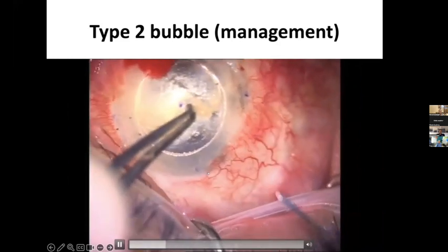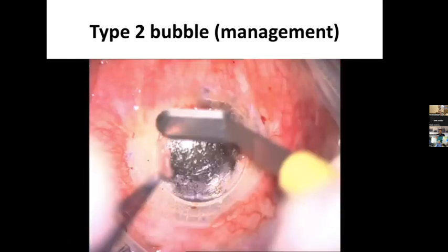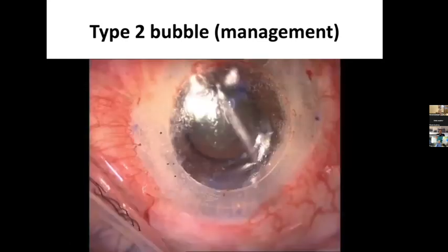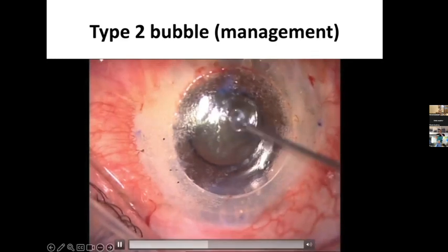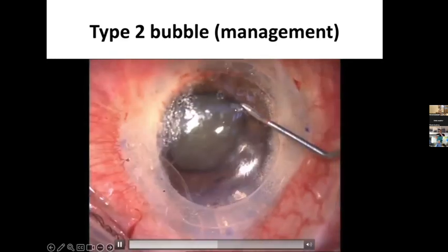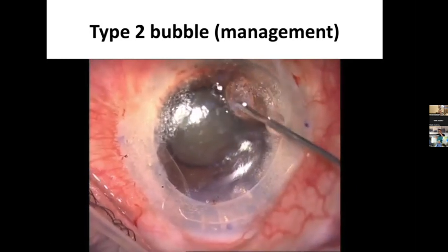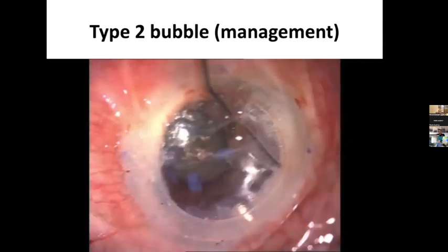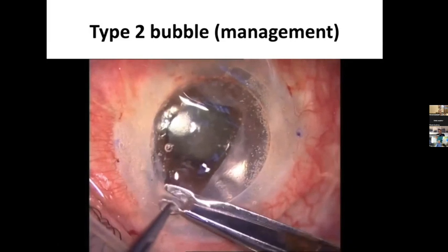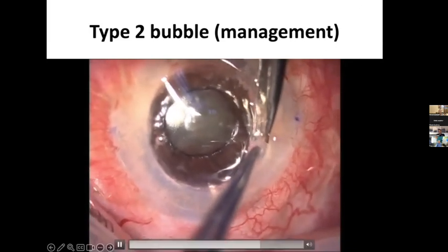So I'm doing the keratectomy, removing 1 or 2 layers of the stroma, using the stromal microbubbles, opening on 1 of the microbubbles, doing manual dissection using the viscoelastic cannula, and removing the stroma, reaching a plane without microbubbles.